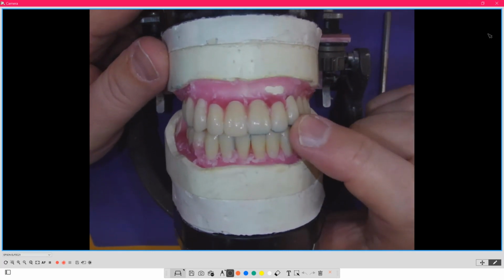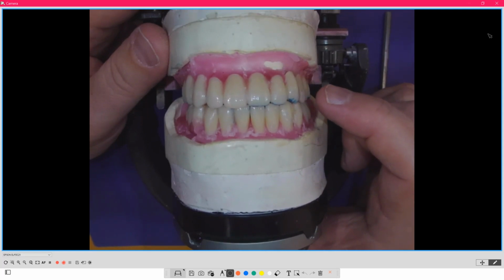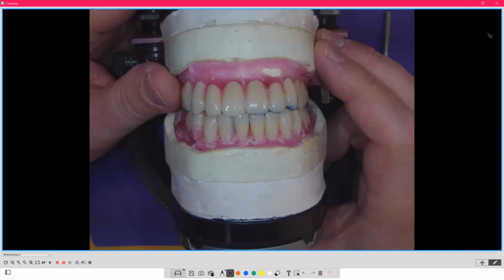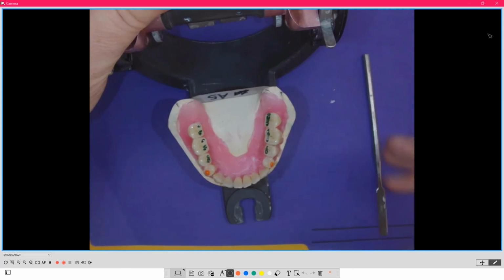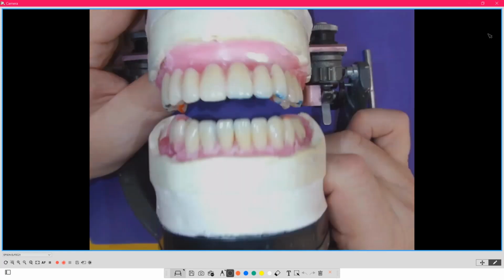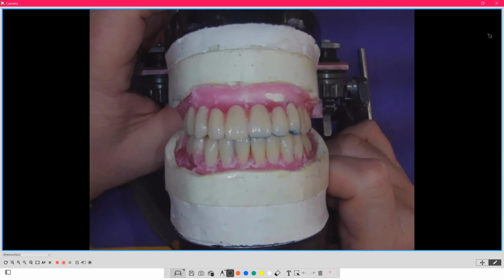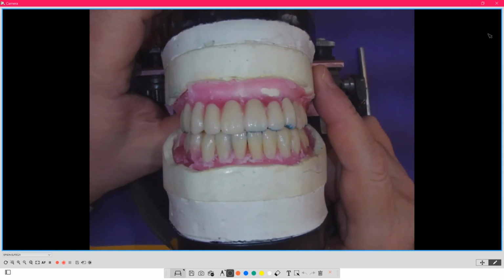I'm building teeth more for their chew cycle and their abilities. And as the patient ages and has more issues and less tone, I'm going to give them more freedom, more flexibility in it. And all I have to do then is just grind the guiding planes to create a little bit of a bigger box to work in for them. Freedom is good. And when you do that, I'm using product that allows me to change and alter myself to the patient, and I'm modifying myself, and then to the patient specifically, and that's the beauty of the VITA teeth.